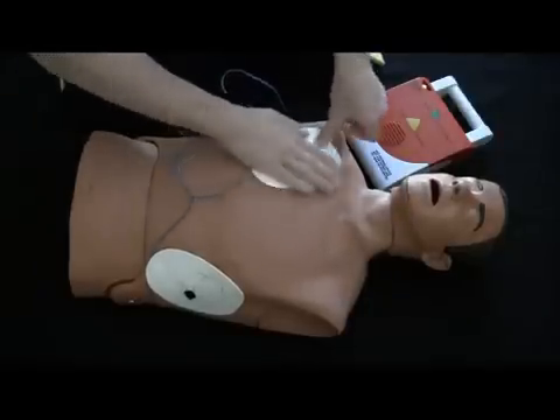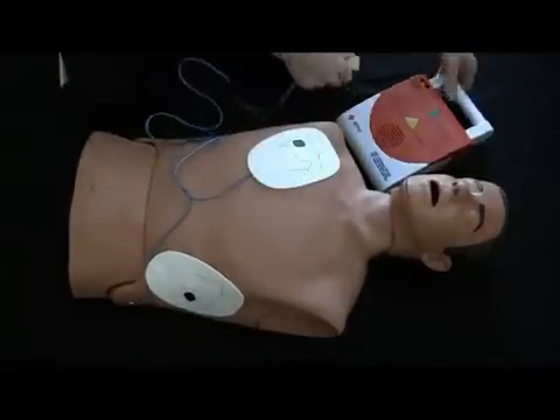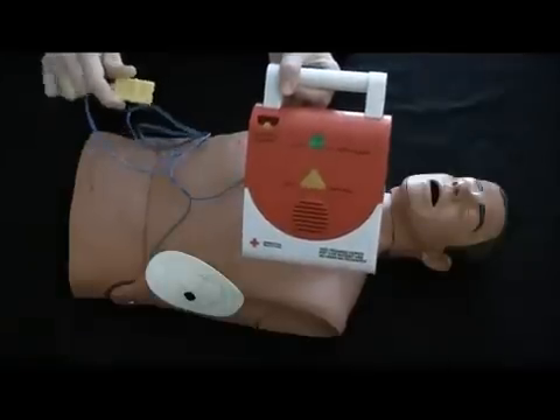Plug in the connector. Check connector and pads.